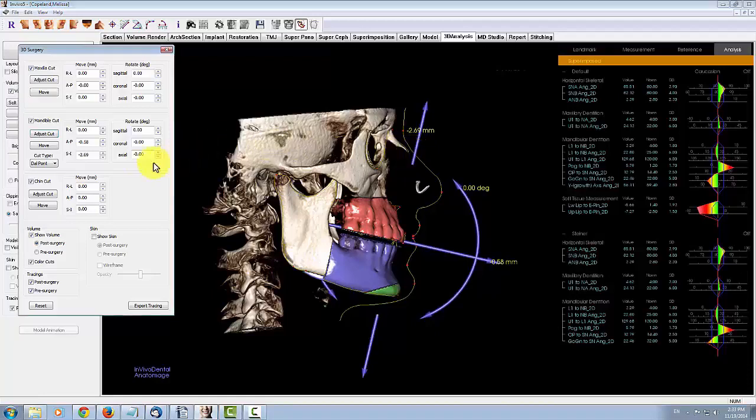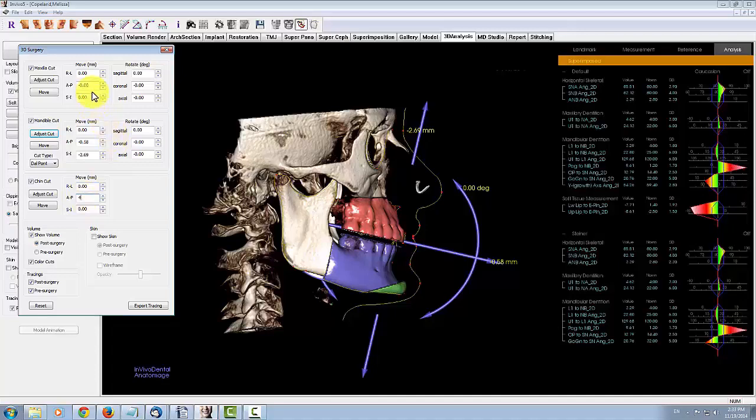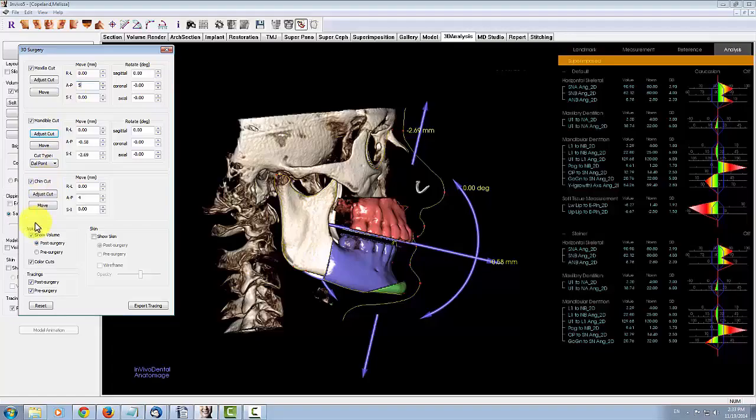You can also manipulate the volume and make finer adjustments to the post-surgery position by entering numerical values in the given fields. Notice how the volume and the measurements on the right both update according to the given values.